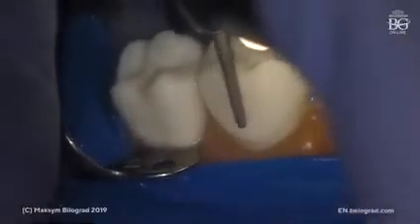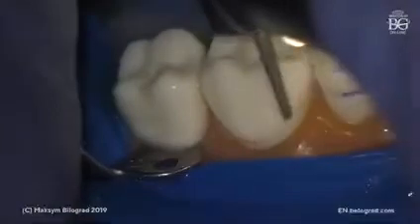Okay, we keep our burr parallel to the middle plane until we lose that mark in the cervical area. Also see that I'm making a prolongation to the mesial part of the tooth. This is important because mesially you can see a transition, so you have to be careful in that term. Otherwise, your patient will not be happy with your veneer case.